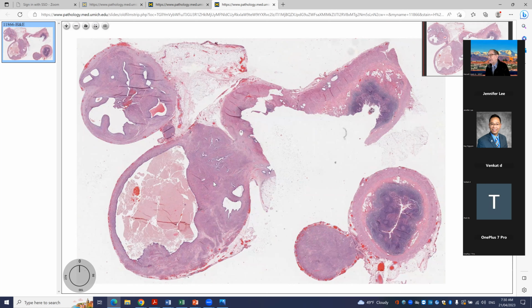It's the combination of the glands and the myomatous stroma that is interesting. Now we know that there is leiomyomatosis disseminata. There is a benign metastasizing leiomyoma. This is essentially the adenomyoma version of that process. And in some situations, this can be pronounced. Certainly can be symptomatic, as in this patient with peritoneal pain or recurring pain and those sorts of things.